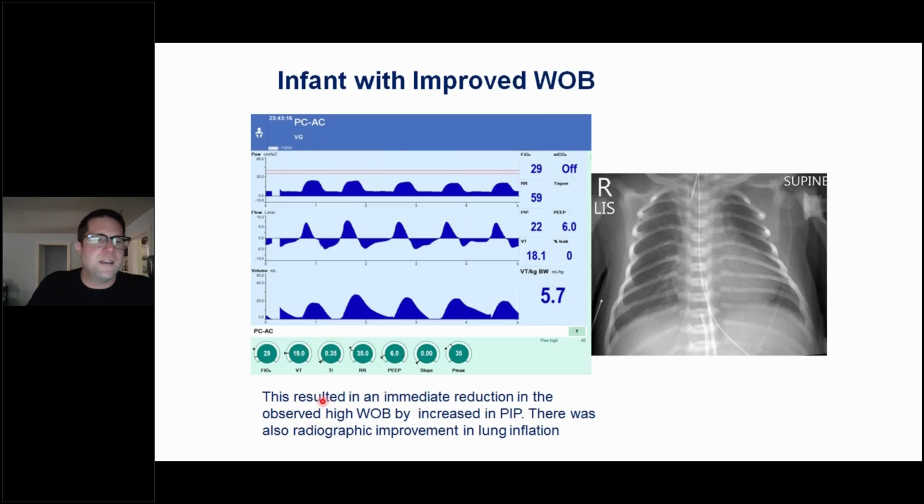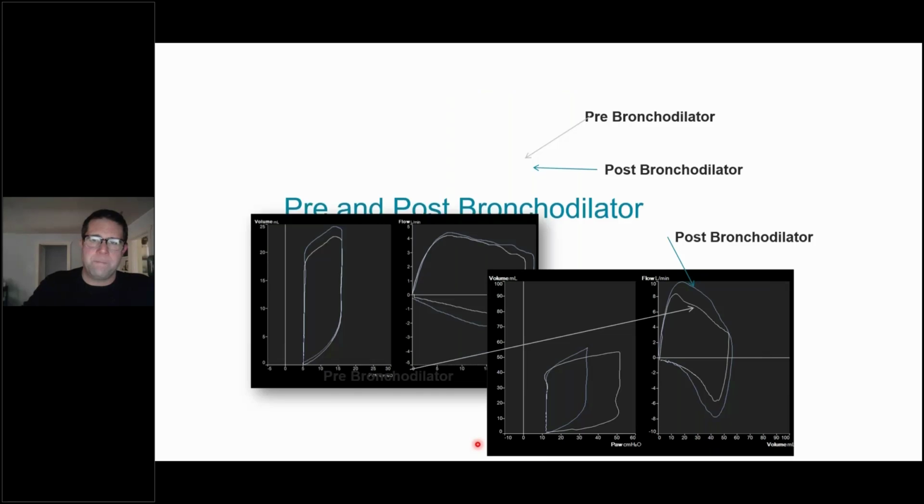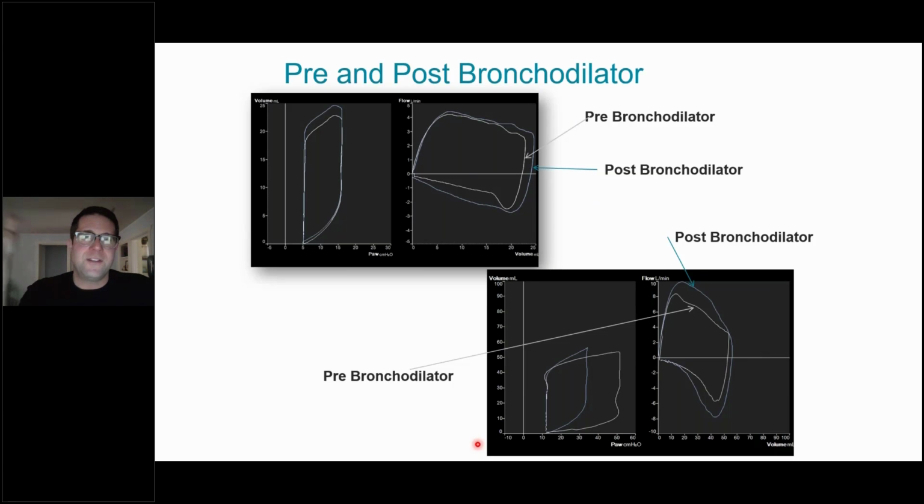So that's such a key component of managing patients on VG, because if you're not updating the tidal volume, or they have changes in anatomic dead space over time, then they will declare to you that, I am not doing well on this mode at the particular settings that we have. And just by slightly going up on that tidal volume, we increased the pressure enough that that patient had better inflation and better gas exchange, and overall looked better. Initially, they looked a little sick, and we thought maybe we have to put them in pressure control, but you're not able to target those tidal volumes specifically in pressure control, and that's not always a good thing. And just by going up on that tidal volume, come to find out we didn't update the tidal volume in a few weeks, then that patient looked better.